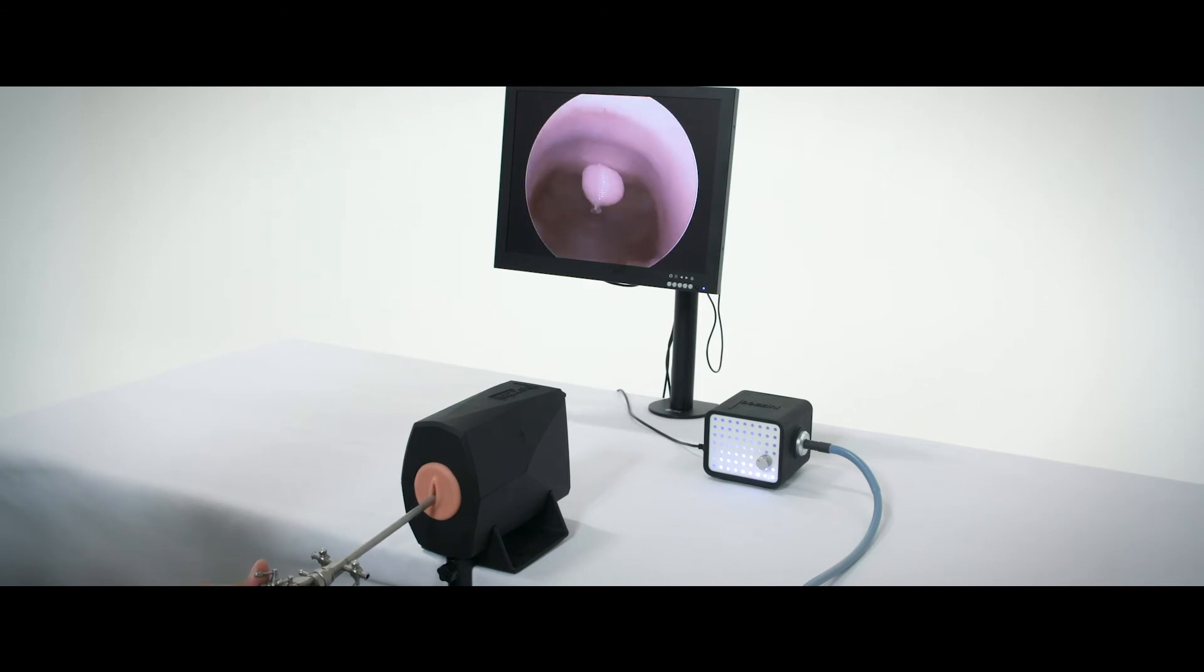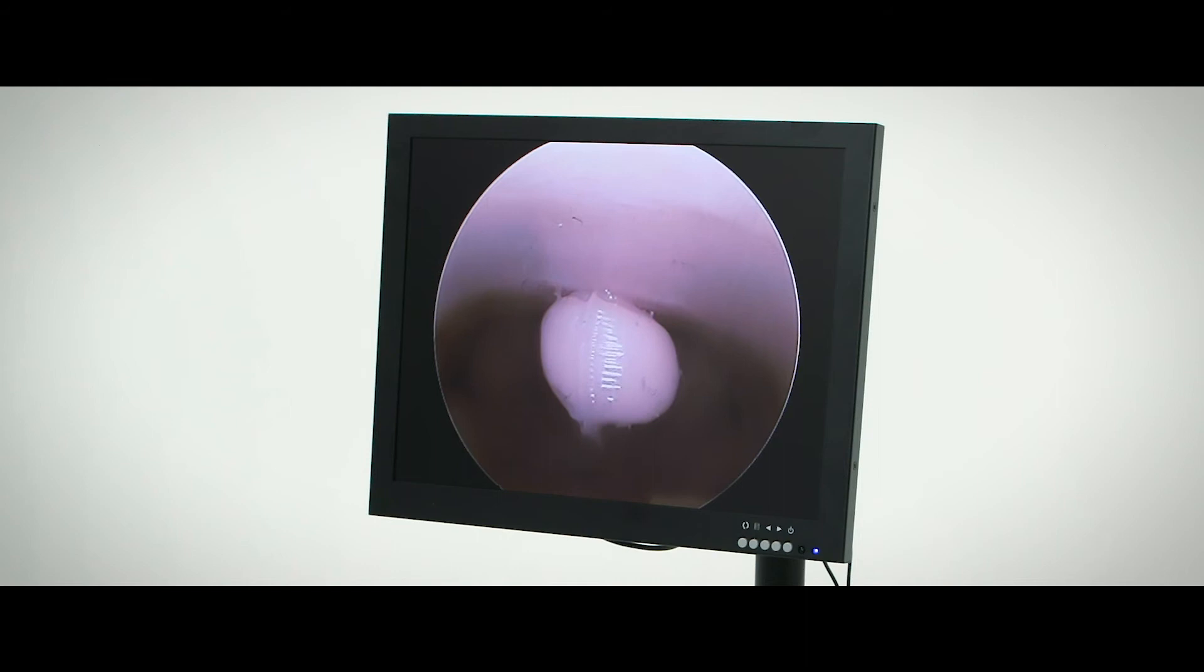Here we can see our polyp pathology. Then as we make our way through to the back, we can view the fundus, we can view each ostium, and then of course we can come back and operate on our pathology.